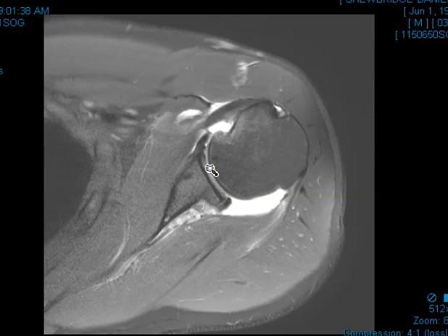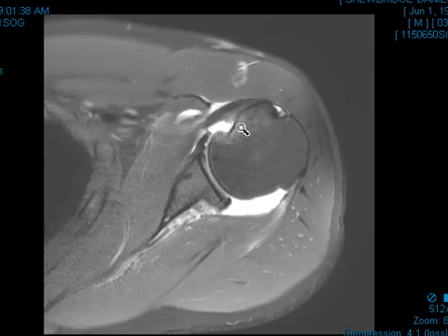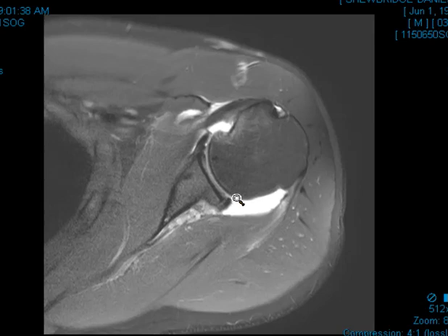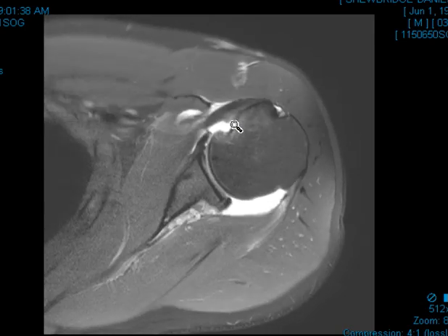This cup is flat and slanted backwards, and it lets the humeral head more easily go backwards. It looks like they've had a prior posterior shoulder dislocation, and we can see that from a couple of things. Number one, we see a defect here in the front of the humerus — it looks like a broad defect. Instead of being a round contour like back here, it has a concavity. This is an impaction injury, an old one, where this went backwards and smacked into the back of the glenoid here and fractured the front, making a defect, then went back to normal position. This has probably happened several times — it's gone backwards, hit, come back into place, and notched out an area here.